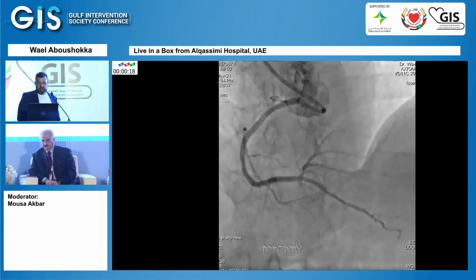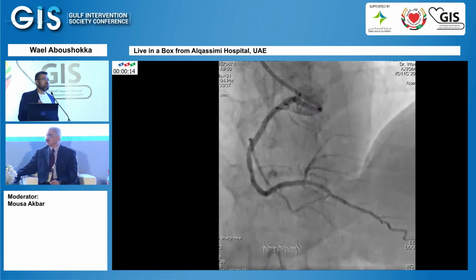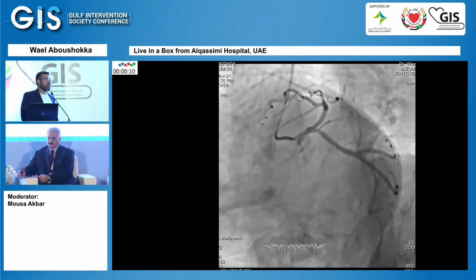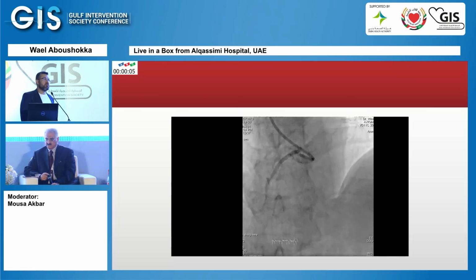So our take-home message: I've been using robotics since 2014, since even in Kuwait, when we had it in Chest Hospital. And really the advancements are very rapid. And in my point of view, it is here and it will be there. It is the future.